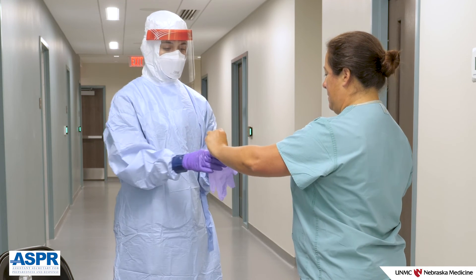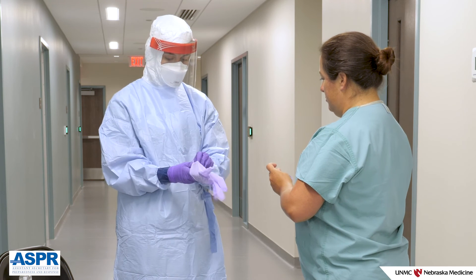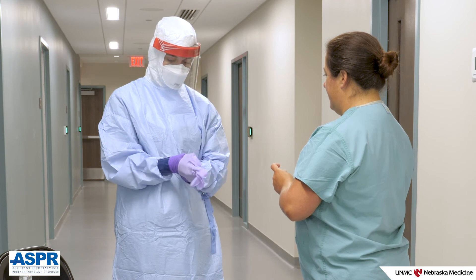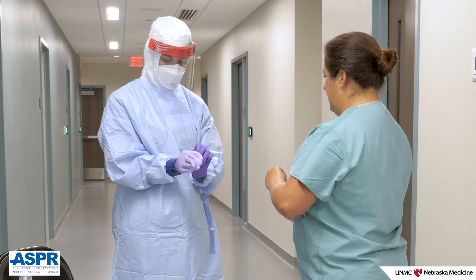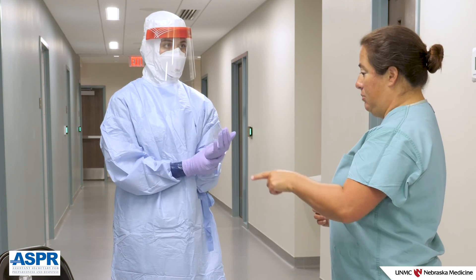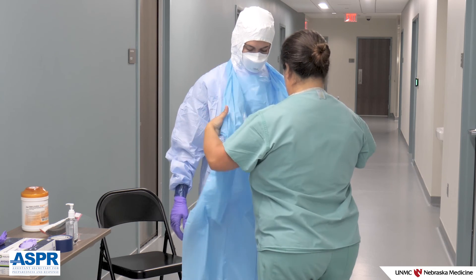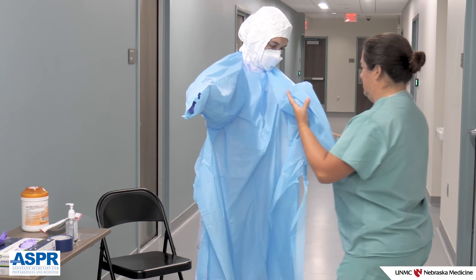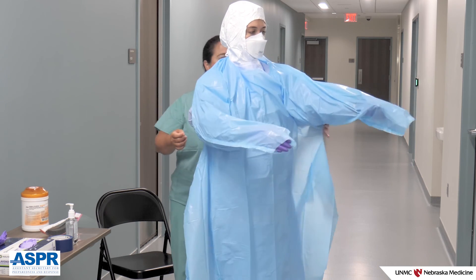The next item to don are your standard patient care gloves. These gloves should be changed when visibly soiled, when torn, and between patient care tasks per standard precautions. If gross soiling is anticipated, the apron should be donned before the face shield is donned. If the apron becomes soiled, it can be removed easily. Remember, the cleaner your PPE, the safer it is to doff.